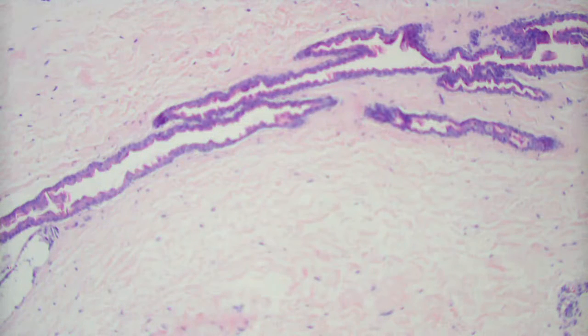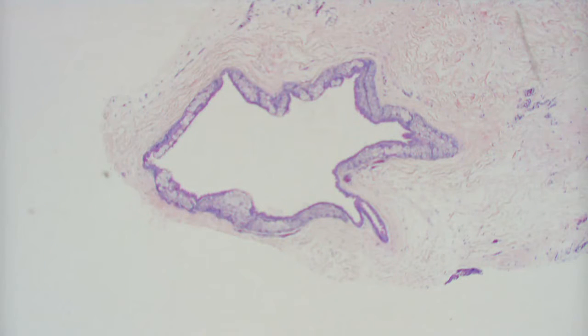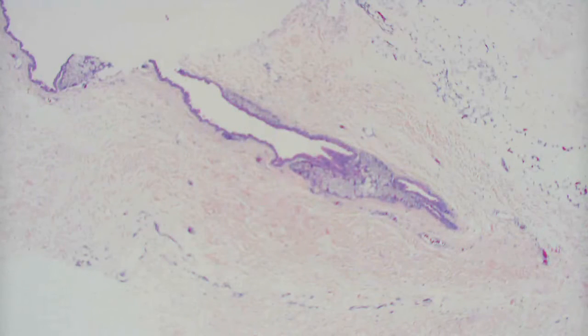And what other kinds of cysts can sort of look like this? I don't know. Anybody know? Dermoid. Yeah, dermoid can have the sebaceous glands, I think, in the wall. That's something else to consider. And then what else? Without a cuticle, it's just a single cell lining, like a hydrocystoma, or single or double cell, but it doesn't have the cuticle. Exactly. Right. We have a cuticular lining like that. And then what about a vellus hair cyst?